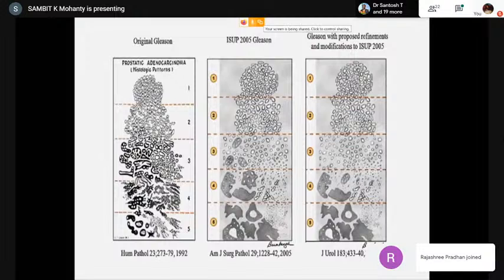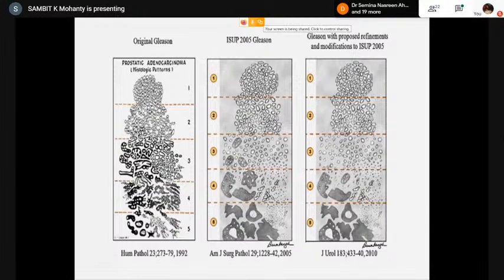So this starts way back from the first publication in 1992. We have evolved into 2010. And if you see here, it was extremely cumbersome before. There is not much change in 1 and 2, but gradually from 3 onwards they are changing. And if you see now, the 3 is a very uniform entity. So there's contraction of 3 and expansion of 4. 4 is getting complex and complex. We'll see that.